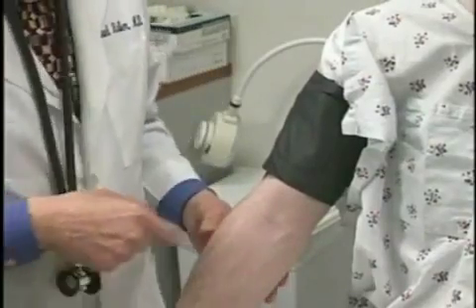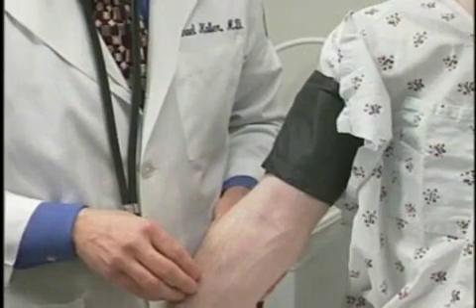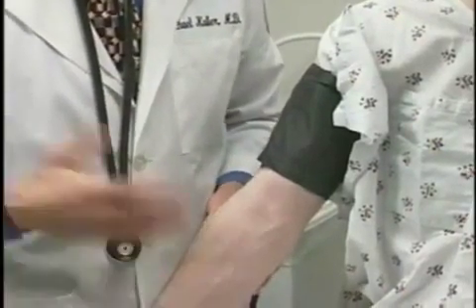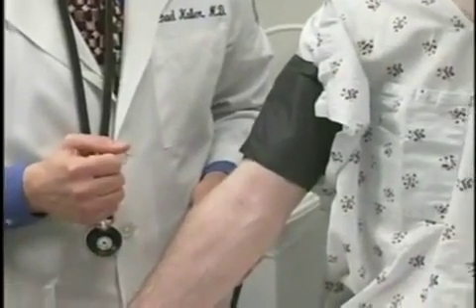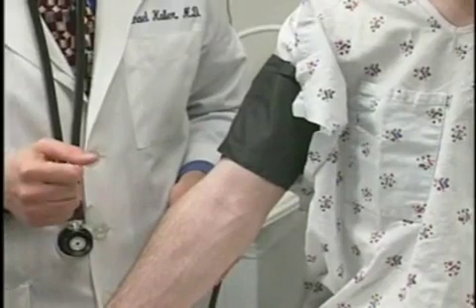Again, the blood pressure must be taken on skin. It shouldn't be taken over an article of clothing or the patient's gown. The patient should be relaxed and calm. Don't check the blood pressure of the patient just rushed into your office, they're late, or if they're crying, because of course the blood pressure will be elevated.